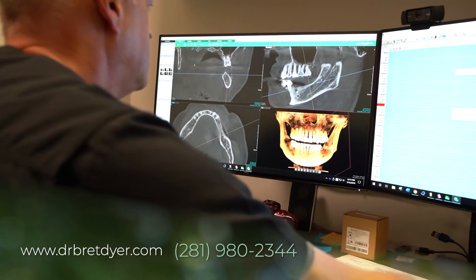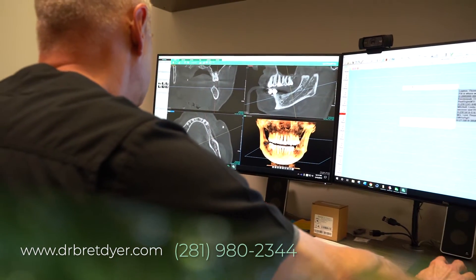We take that 3D image and a 3D impression of your teeth and merge those together in a CAD program on our computer. After I've merged it, I place your implants virtually, I design the teeth, and we design the whole case from start to finish.